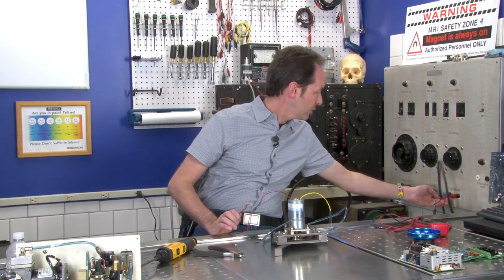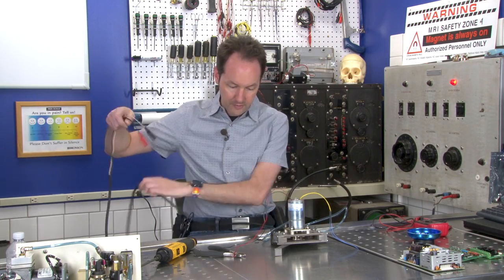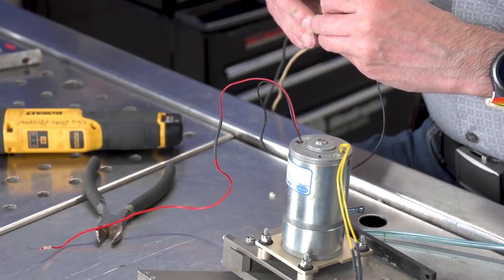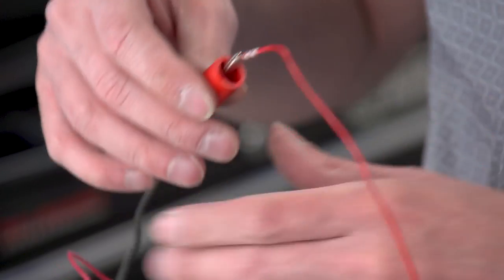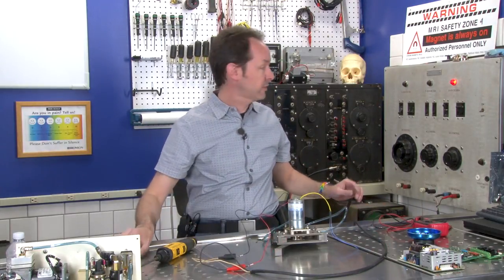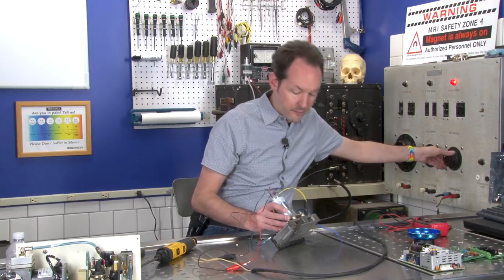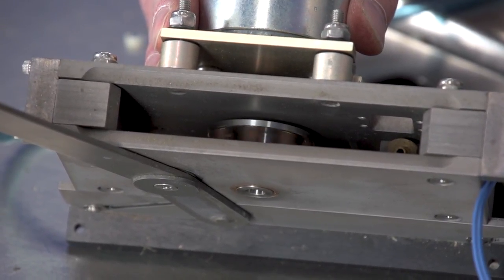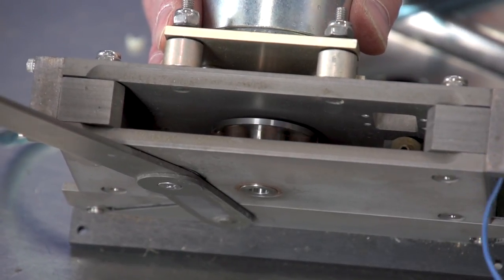We'll grab 12 volts DC and clip onto this. Let's give it some voltage — if you look in here, you should see this start to turn. Ooh, it's a gear drive! That's a really nice little motor. I like it.